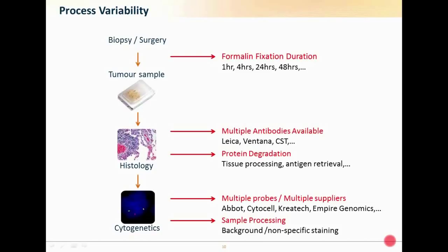And if you're setting up a new assay where you're not actually sure you've got a positive result, non-specific staining for either IHC or FISH can be a real problem, because when do you know when a false positive isn't actually a real positive? And without reference slides to help you along the way, you could be using a lot of your precious patient samples trying to understand and get an assay up and running and optimized.